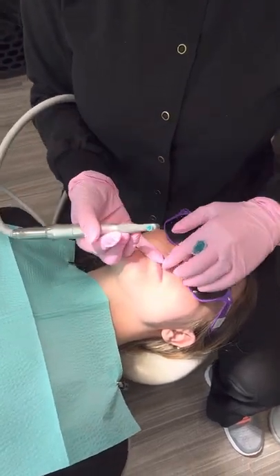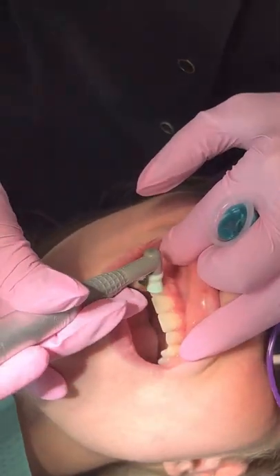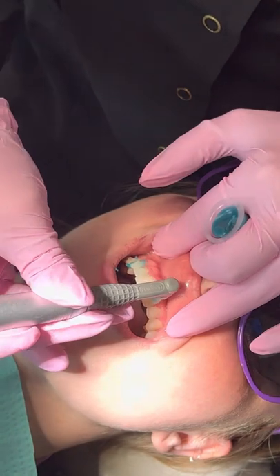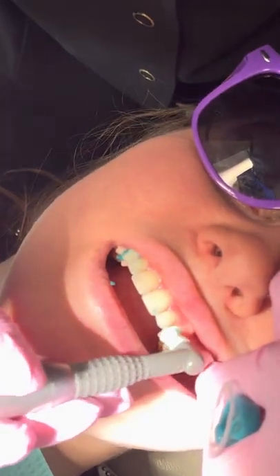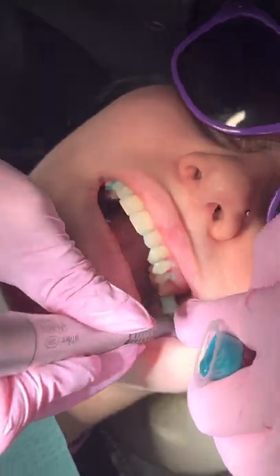Using this hand, I'm going to retract the patient's cheek and begin brushing. As I'm brushing, I'm taking this and looping it around the patient's teeth, making sure that we see that white blanching — how it turns white in color right there. That will ensure that you're getting underneath the gum line. Currently I'm brushing all of the buccal and facial surfaces.